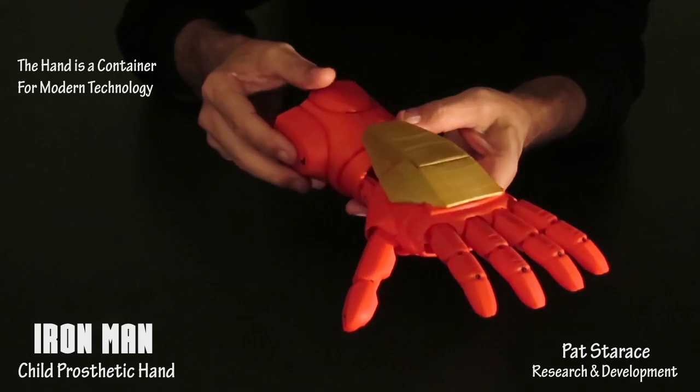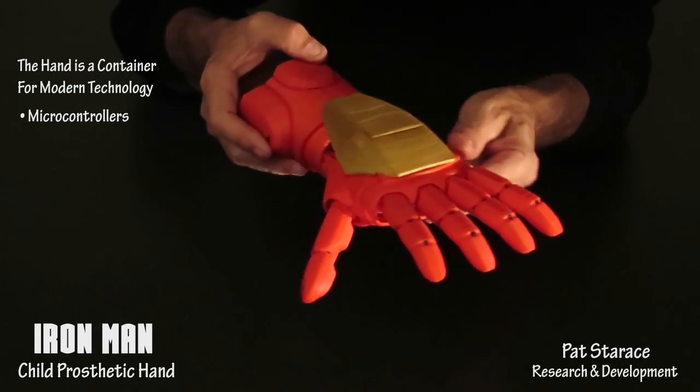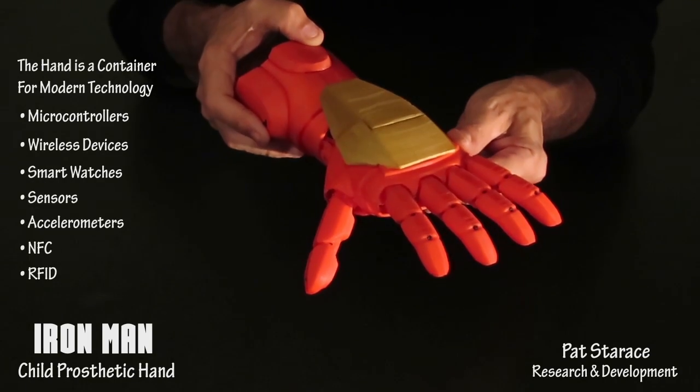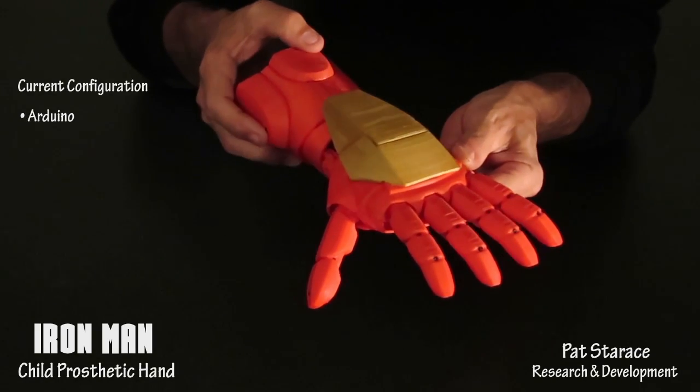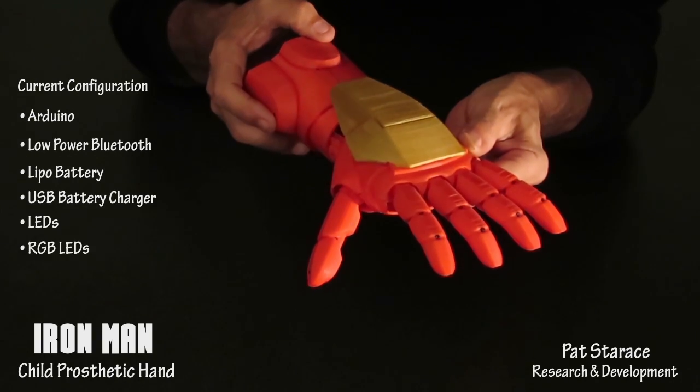The hand is a container for all modern technology. It can incorporate microcontrollers, wireless devices, smart watches, sensors, accelerometers, NFC, RFID, and almost anything. This hand is configured with an Arduino, low power Bluetooth, a LiPo battery, a LiPo charger, LEDs, and RGB LEDs.